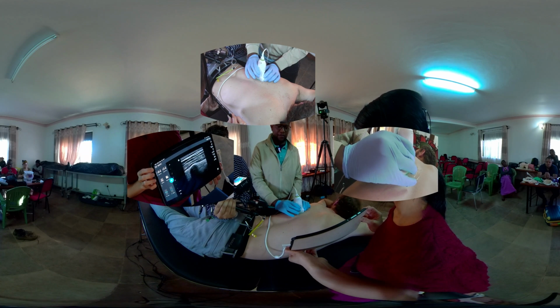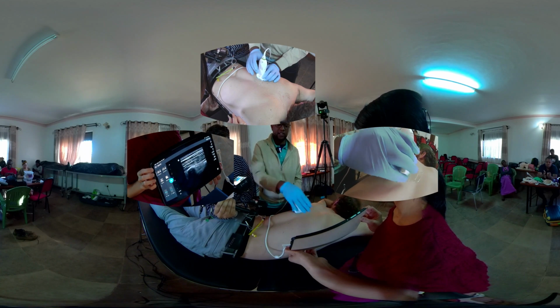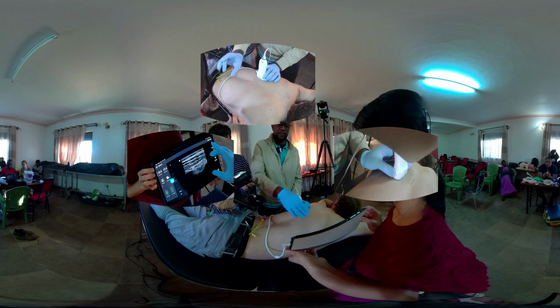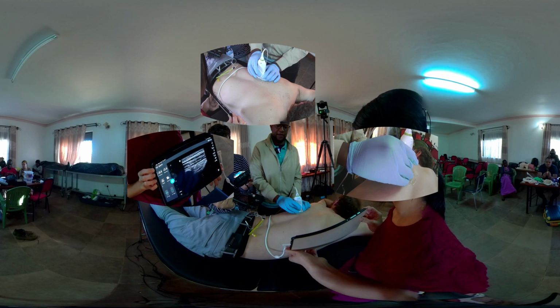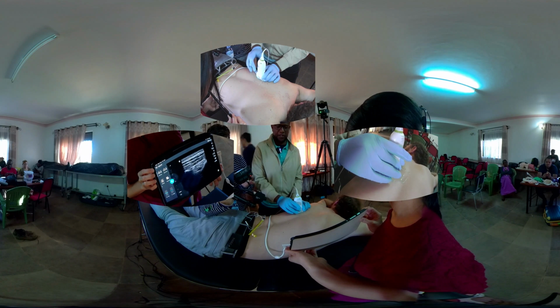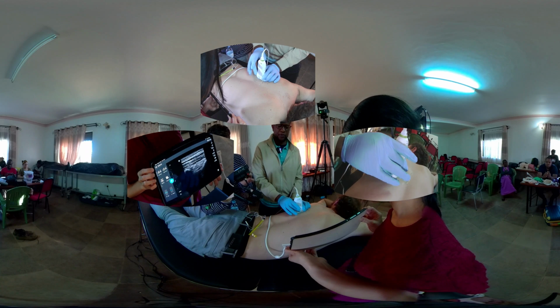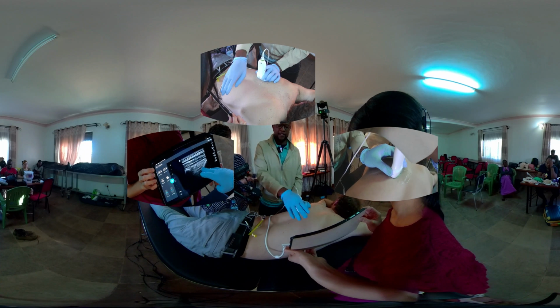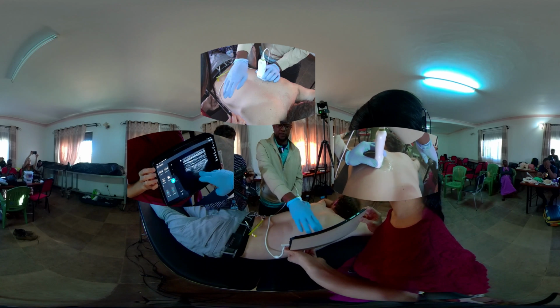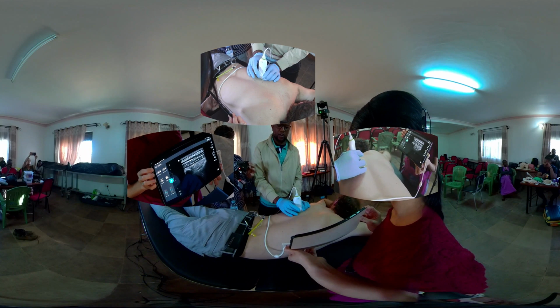And right about there, if you see on your screen, the image that we have there is a structure that's more flat at the top. And your erector spinae will vary in thickness, depending on the musculature of your patient. So that looks like a good image to me. Bear in mind that as you go beyond, you see a white line, a white structure there. That's the pleura, and it should be avoided to avoid the pneumothorax.